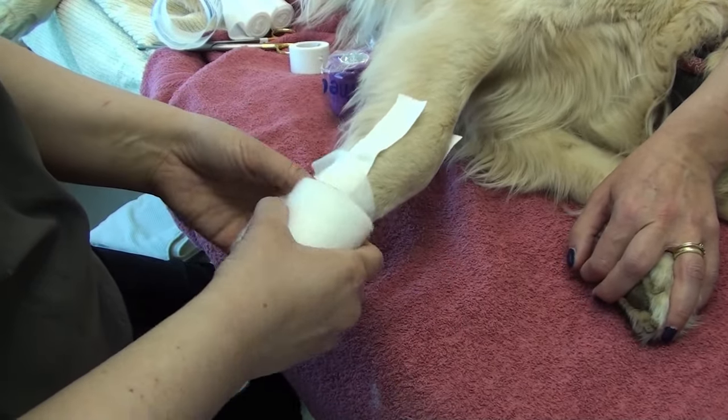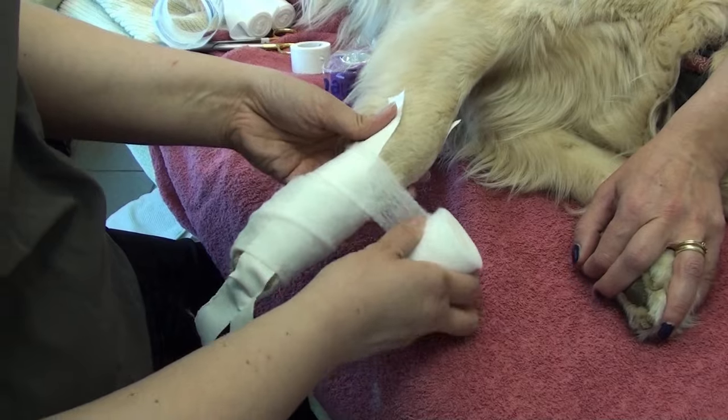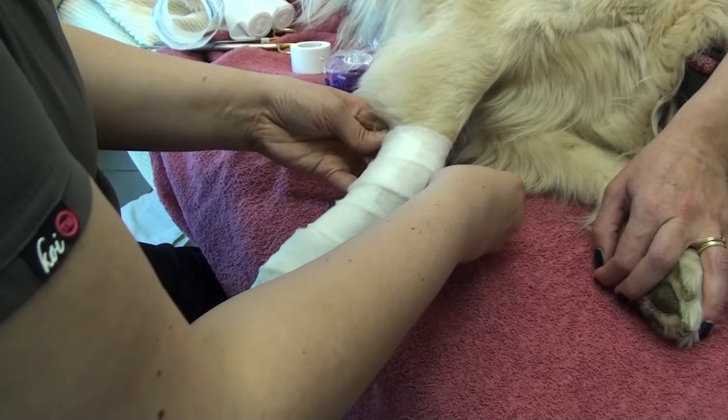She starts with the stirrups and some cast padding, and then she's just going to apply her cling, adding a little bit of pressure — it's just to hold everything in place.